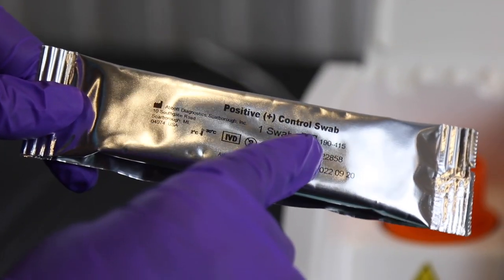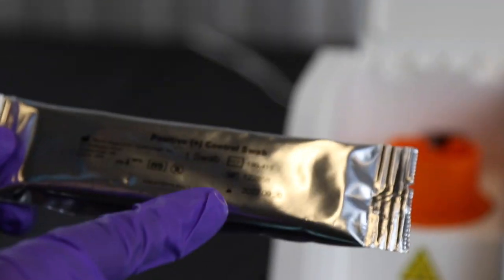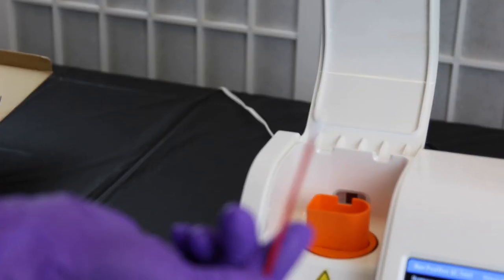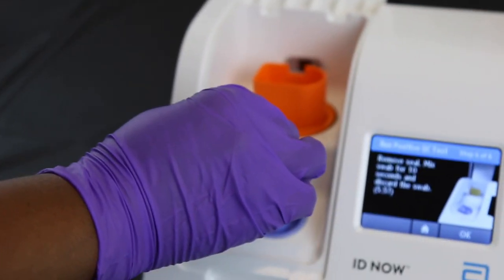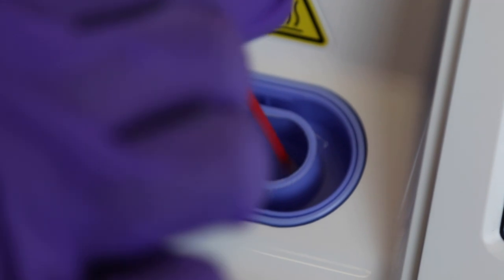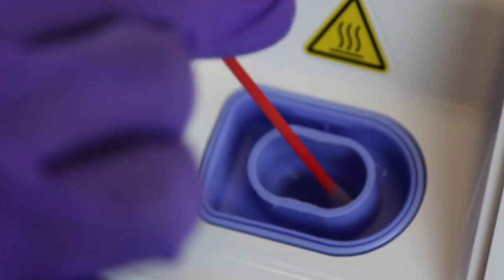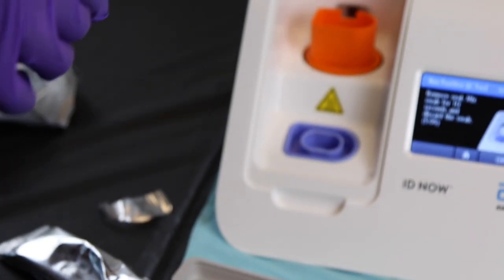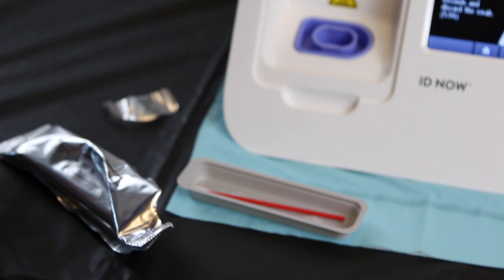Both negative and positive quality control swabs come in foil packaging — one marked positive and one marked negative. Take your positive or negative swab and rotate it in a circular motion for 10 to 12 seconds. You have seven minutes to complete this; if not completed within that time, your QC test will be rejected. Temporarily store the swab to the side — do not discard it yet. If your QC is invalid, you can reuse the swab on the next attempt.